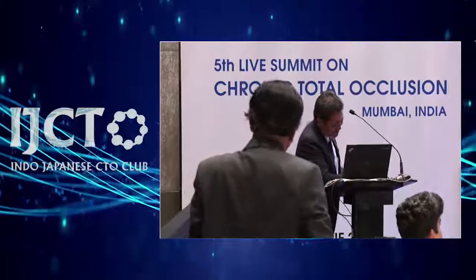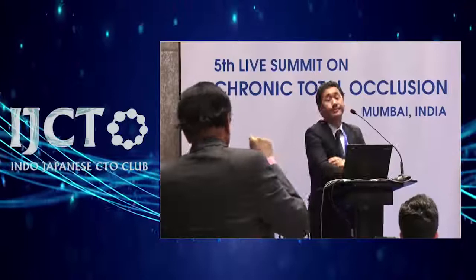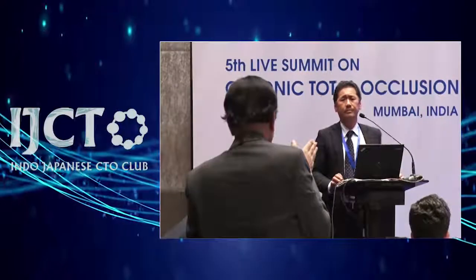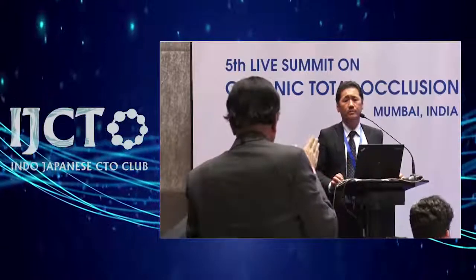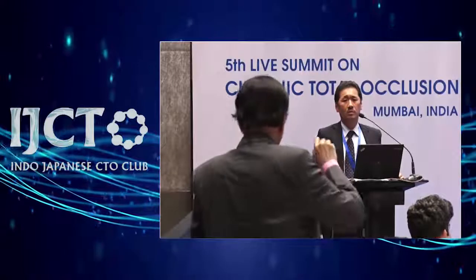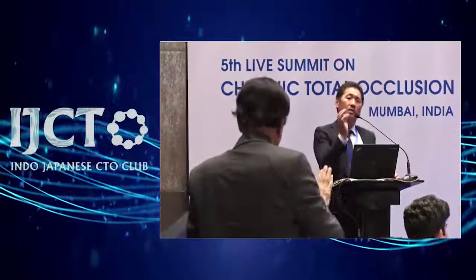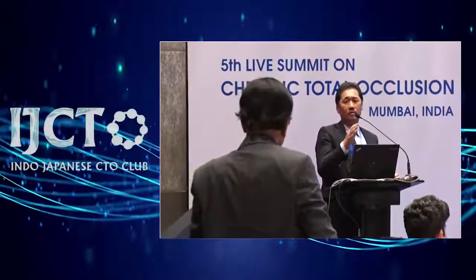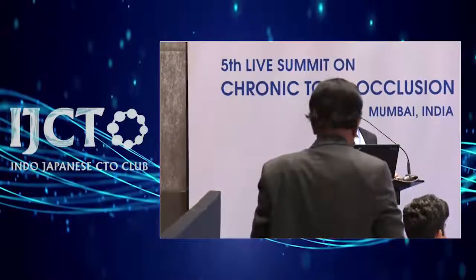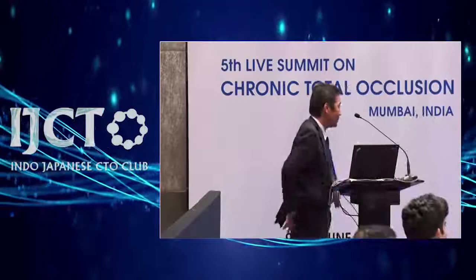Thank you. Another question, Dr. Hamadaki. The central lumen of the catheter is actually on one side of the catheter. Does it make a difference whether it is towards the wall or whether it is towards the lumen? Doesn't make a difference? The direction of the hole is not important. Okay. It is not necessary to rotate. Thank you very much. It's wonderful actually.